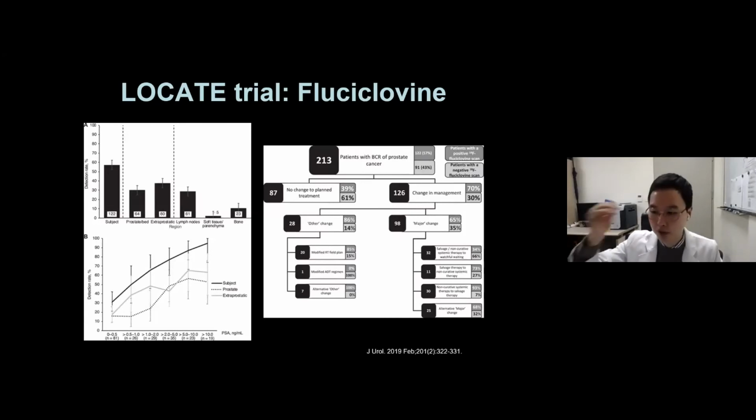And some interesting point was that the detection rate actually had increased proportionally to the pre-scan PSA. So if the PSA level is high, the detection rate gets higher. But one thing should be seen is, although lesser than the PSA grade 1, there still is near 50% of lesions were detected, although it was in lower than 1 or 2.